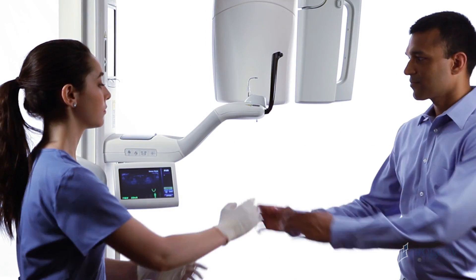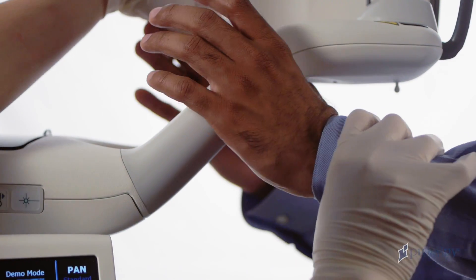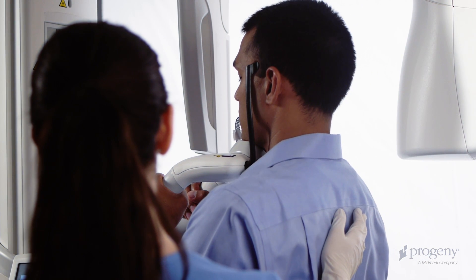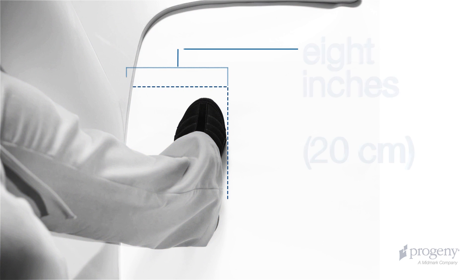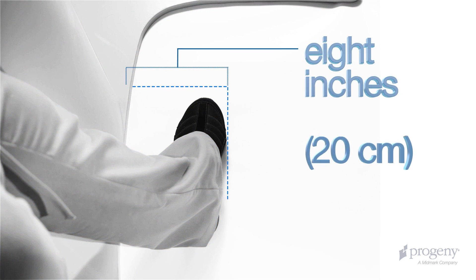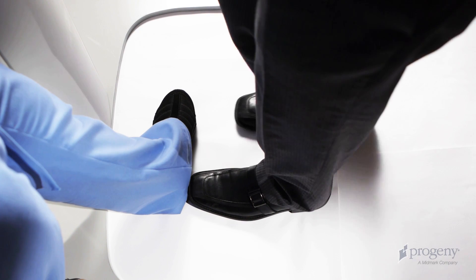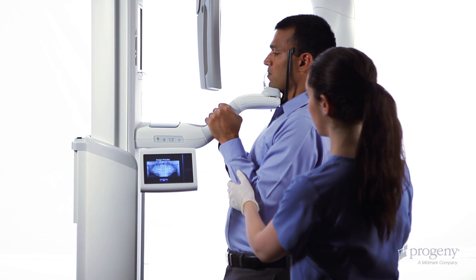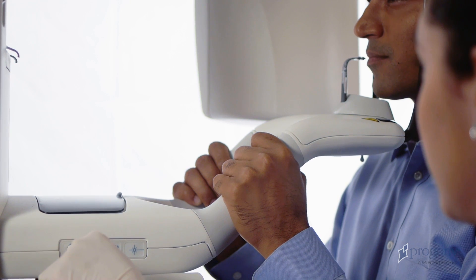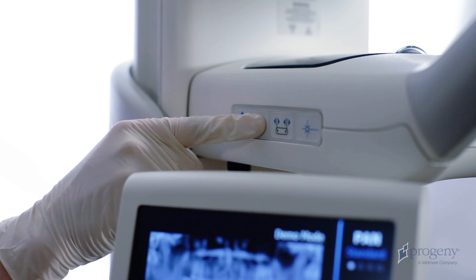Instruct the patient to place their hands on the stabilizing grips. Gently guide the patient towards the vertical column. Instruct the patient to bring the toes in contact with your instep, which will be placed approximately eight inches in front of the vertical column. Ask the patient to stand at full height and relax the shoulders. Adjust the vertical height of the positioning table using the two control buttons and place the patient's anterior teeth in the bite piece grooves.